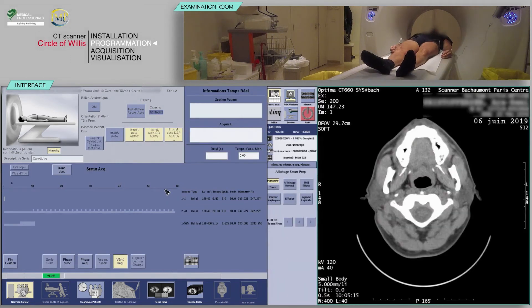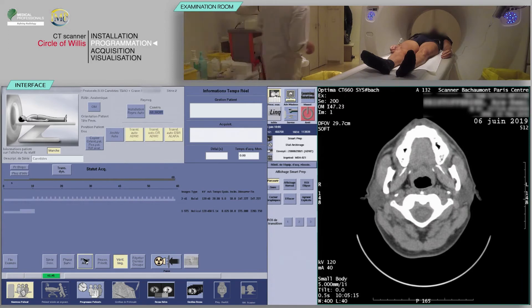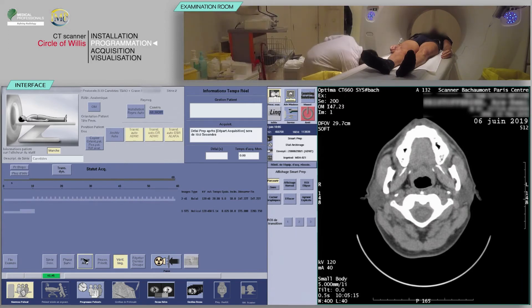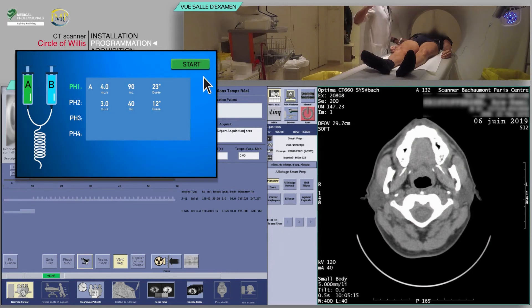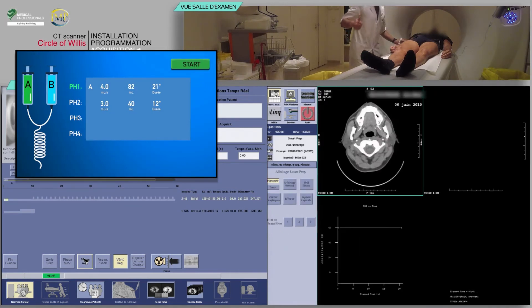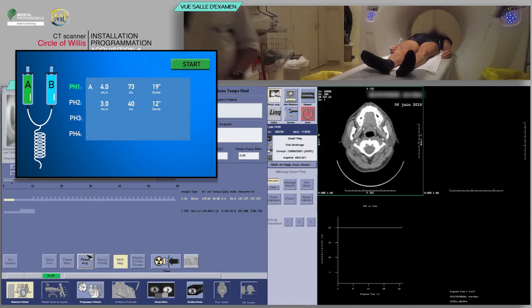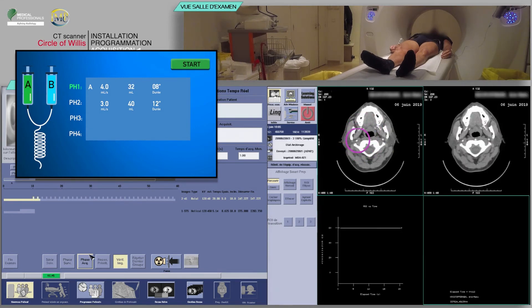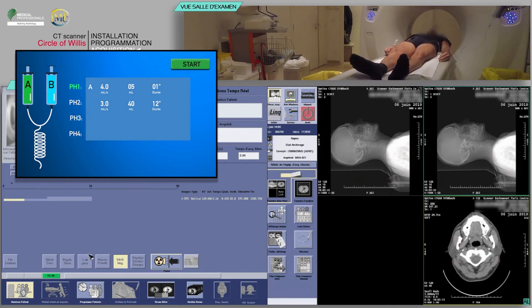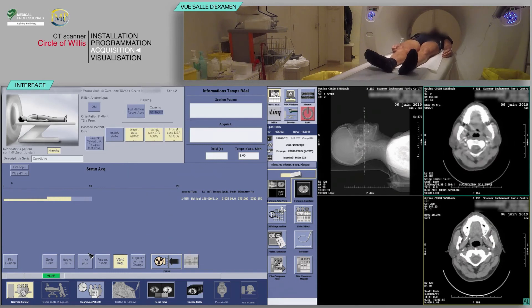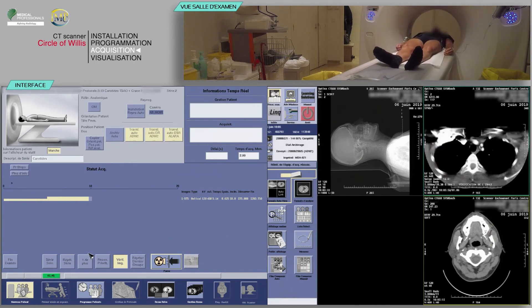Make the control slice and click on Monitoring Phase. Start the injection and acquisition at the same time. On the control slice, attention should be paid to the arrival of the contrast agent in the carotid artery. Click on Phase Acquisition to start the acquisition at the specified time to achieve excellent vascular enhancement. Check for the absence of breathing or motion of the patient during the acquisition.